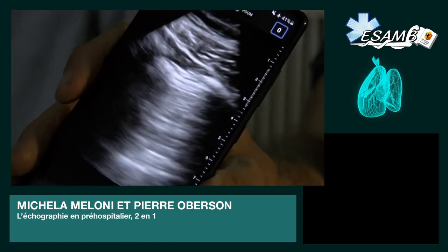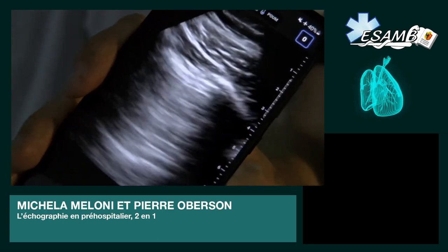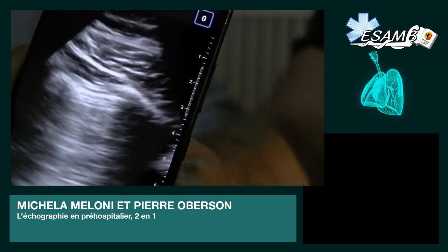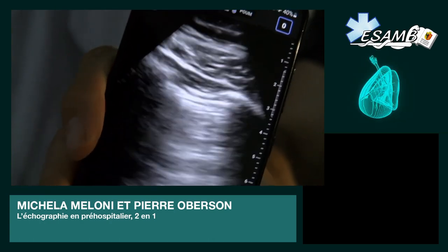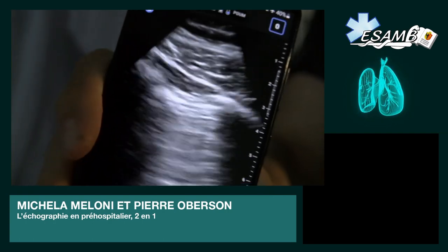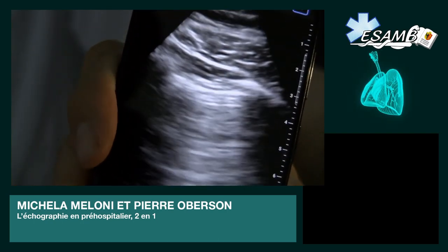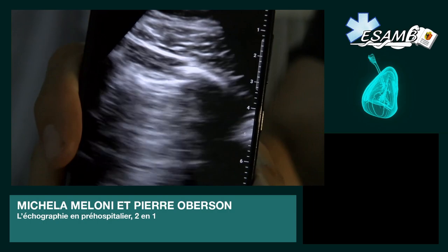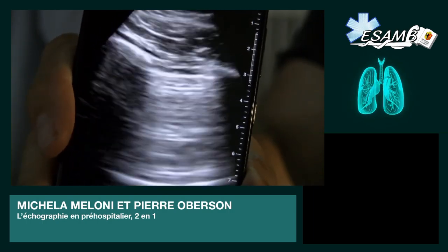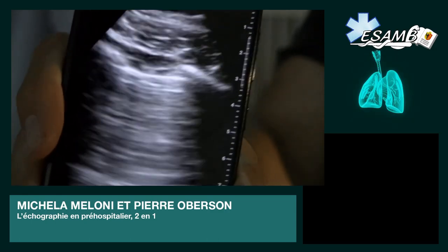On peut voir que j'ai juste posé la sonde sur le thorax de Luc, et on peut déjà visualiser son poumon. On peut bien voir la plèvre de Luc qui bouge à chaque respiration, ce qui montre bien qu'il n'a pas de pneumothorax, et puis il a des lignes A. C'est un bon signe que son poumon va plutôt bien, ce qui est rassurant parce qu'il est jeune et en bonne santé.